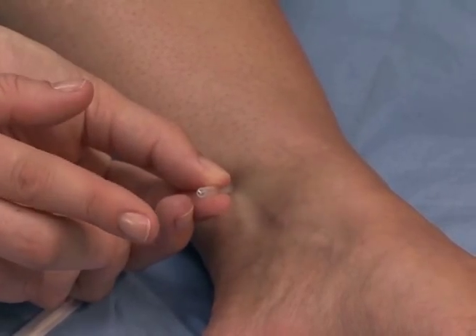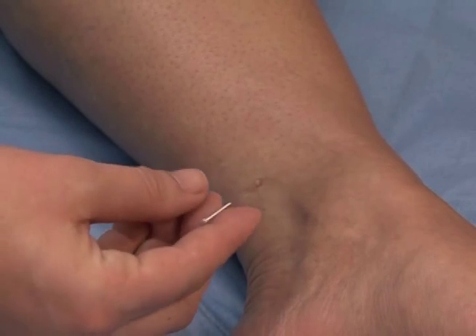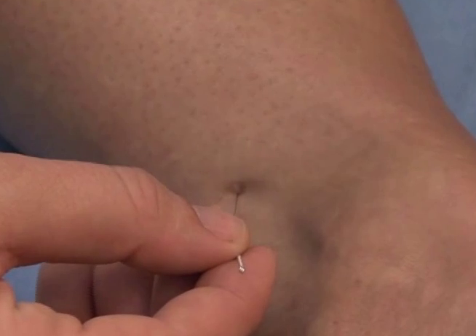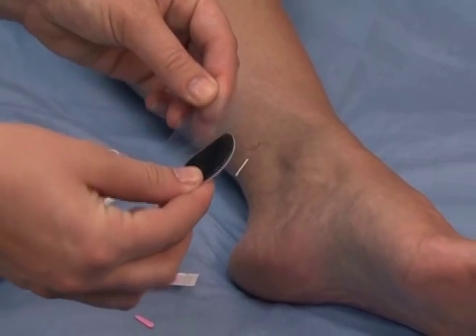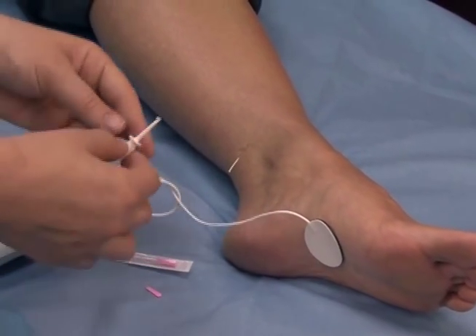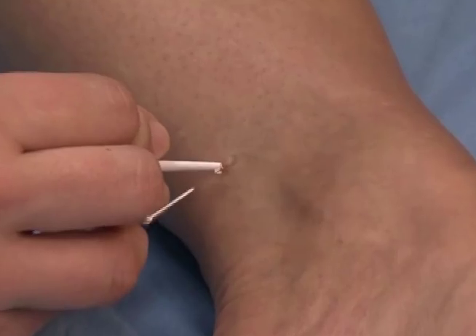Patients may feel the tap of the needle as it pierces the skin and is inserted. The clinician attaches the adhesive surface electrode to the bottom of the foot, which acts as a grounding pad for the electrical current, and then attaches the needle electrode clip to the needle electrode.